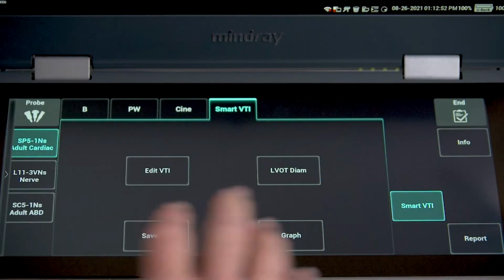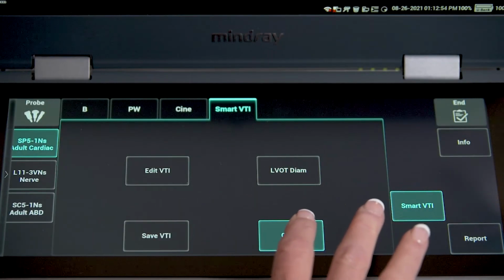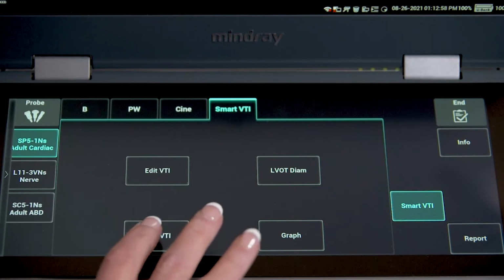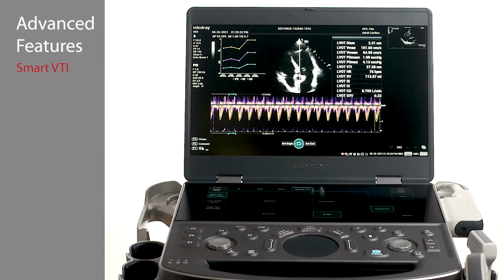By turning on the graph and tapping Save VTI, the system can plot multiple data points for the patient. The data from Smart VTI can be found in the Fluid Management report type.